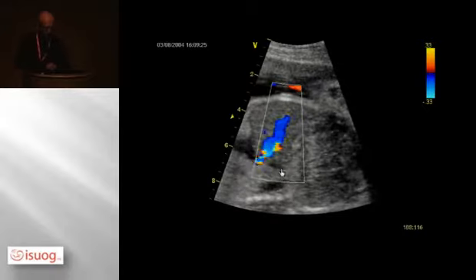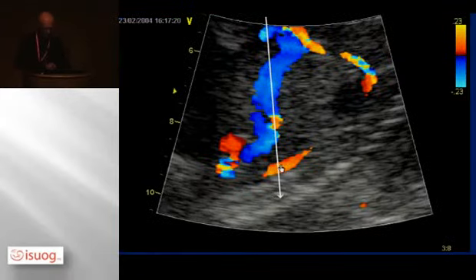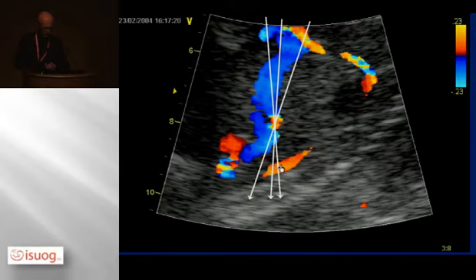So then you have the color on, and then the question is, is this okay? Or this, or this, or this? All of them are okay. And the reason for that is that the ductus venosus is not necessarily a straight line, but curves until the ductus venosus points at something like 50 degrees towards the IVC. So from going in this direction, it starts out and then it curves up. If you angle correct on this point, you have quite a risk of overcorrecting. So I would prefer, if you are not sure that you have the right insonation, repeat it and take the best you have.